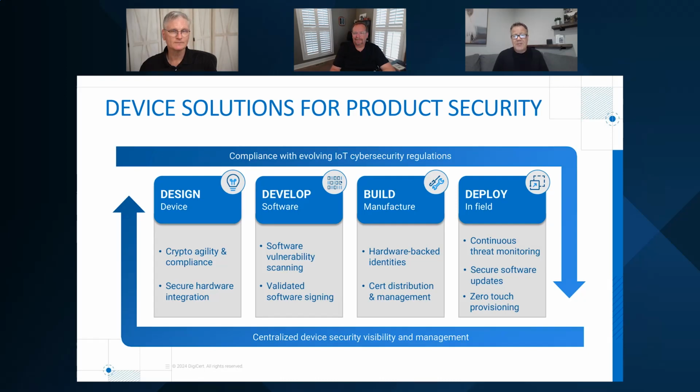Yeah, that's a great question. Utopia, what does utopia look like? Right. So we're probably never, most medical device manufacturers will never get to utopia, but in a perfect world, we'd see security in the design phase early on. Security being thought about when you're selecting the hardware. Does that device have a secure element, a trusted execution environment, a TPM, something where secrets and keys can be privately and securely stored?